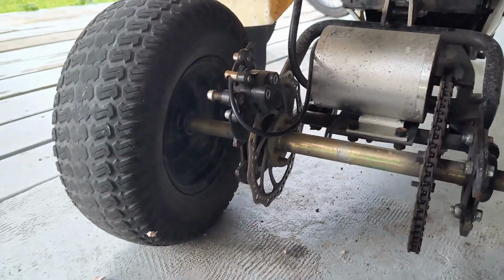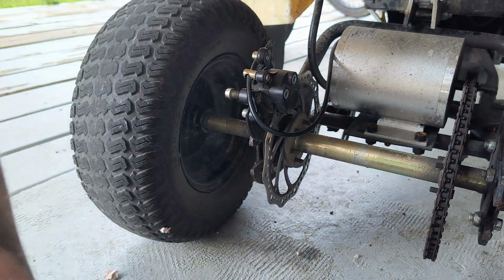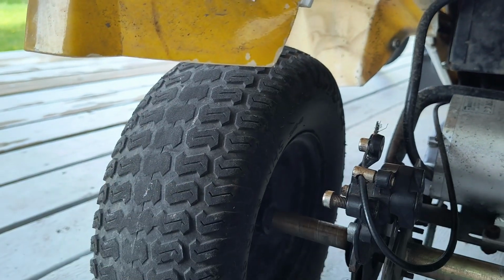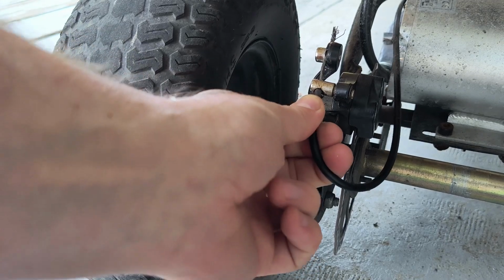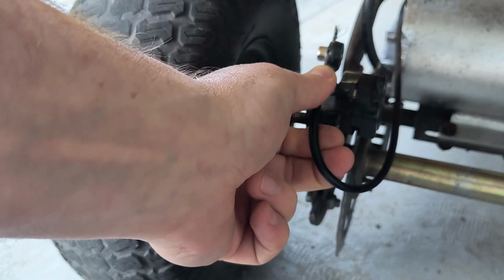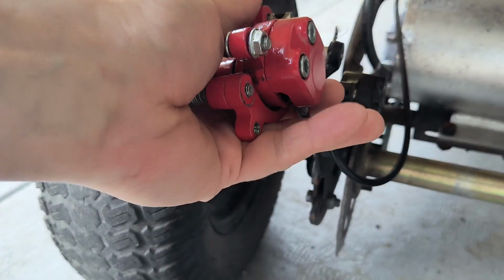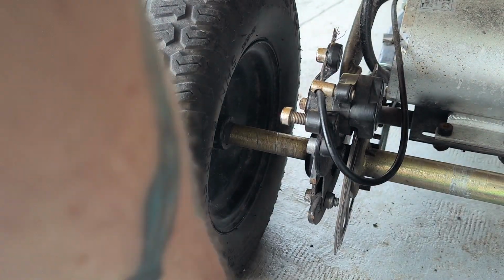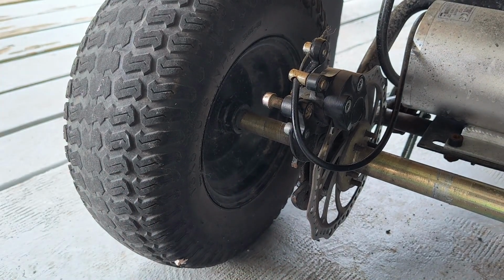Okay. Let's have them do these brakes. As you can see, the cable on this is set up backwards, which is to say it's pulling from the back forward. That's wrong. It should be pulling from this side, which these ones are set up to do. So, get the Allen key out and disconnect them, and then I'll see if I can put it all back together.